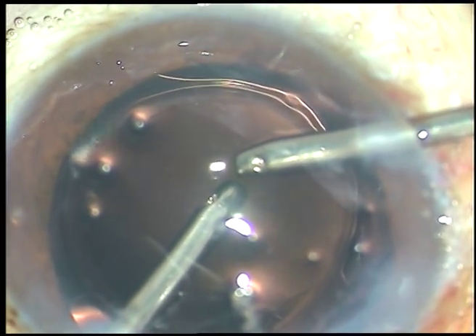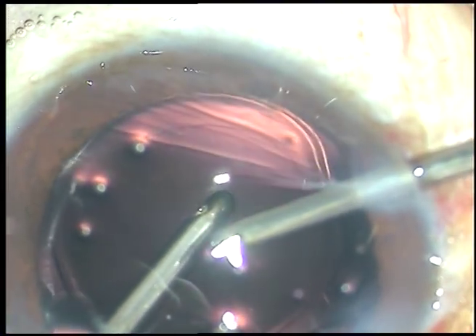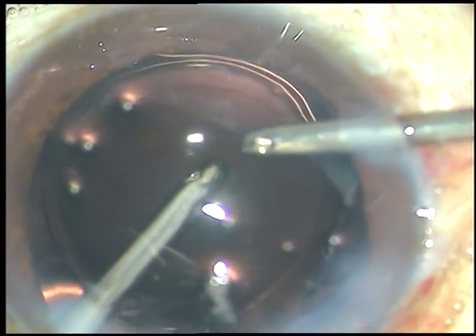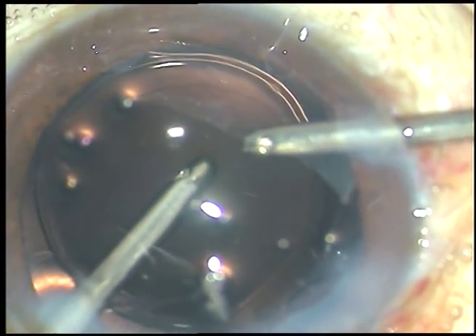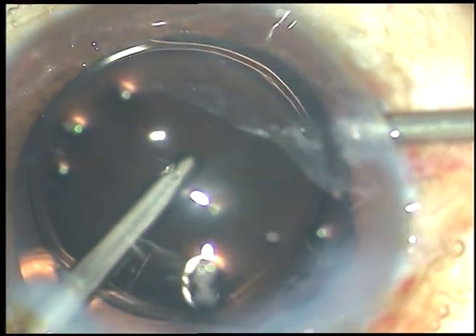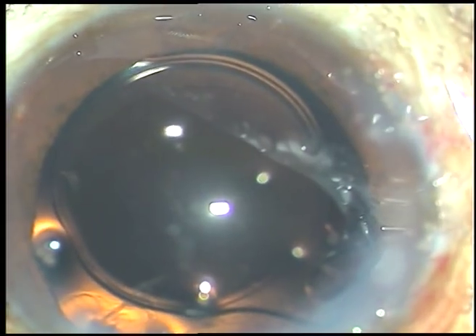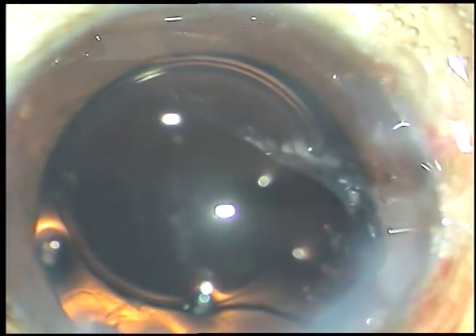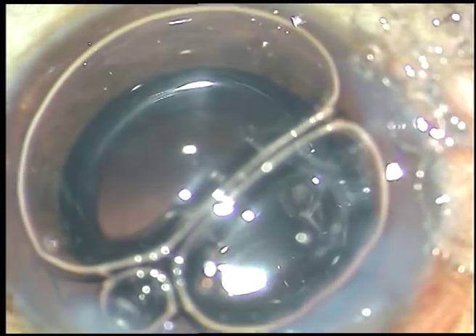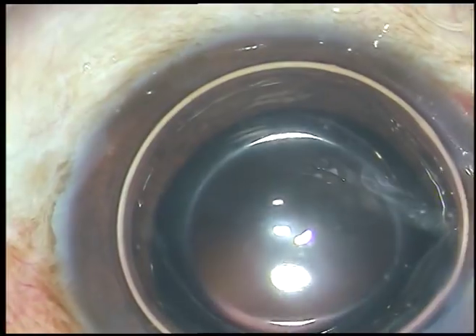Now, what happened is during this process of cleaning of viscoelastic substance, the irrigating fluid hydrated the vitreous and it prolapsed out through the dehiscent area. You can see the lens is being pushed towards 6 o'clock, so I inject some air to support it.